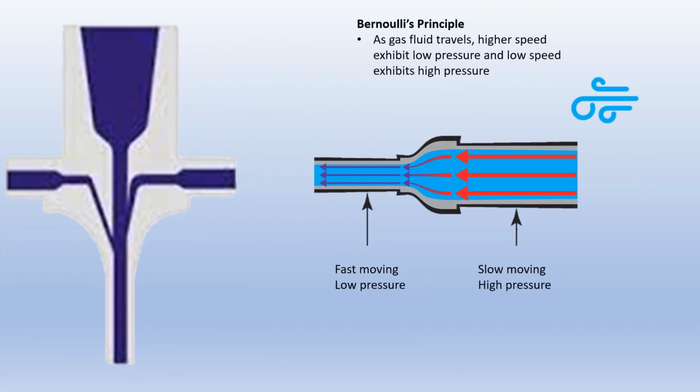As fresh gas travels down the line to the life port adapter, the Bernoulli effect causes changes to the flow of gas. As the slower, higher pressure gas in the large tube enters the orifice, where the diameter of the tube is reduced, the gas increases in speed while the pressure decreases. These high-speed, low-pressure pulses travel through the life port adapter and down into the patient's airway.